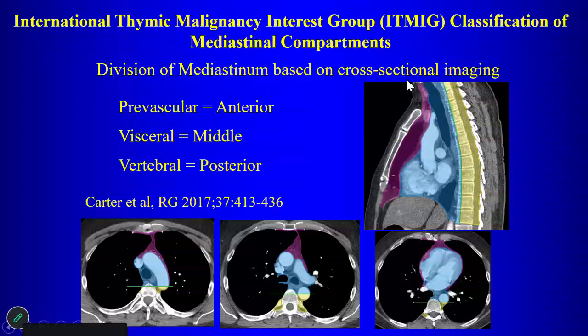Now there is an official classification of the mediastinal compartments put out by a society. This is the International Thymic Malignancy Interest Group classification of the mediastinal compartments, and this is based on the appearance on CT. So if you're asked questions on exams about the different compartments of the mediastinum, this is the scheme that you have to use.